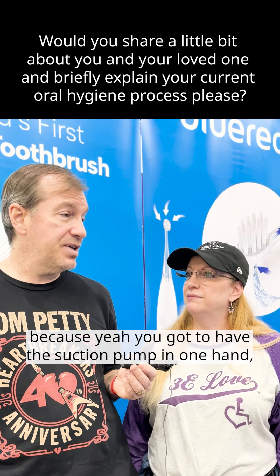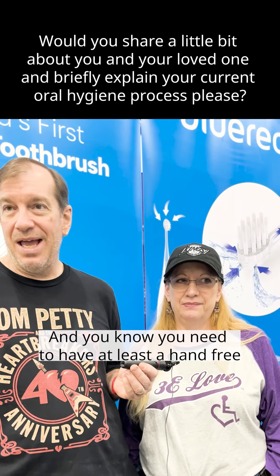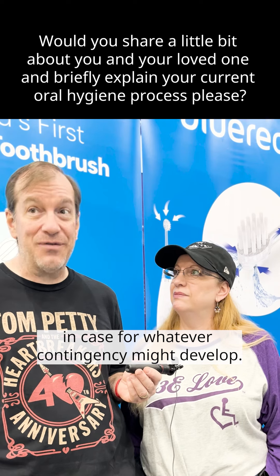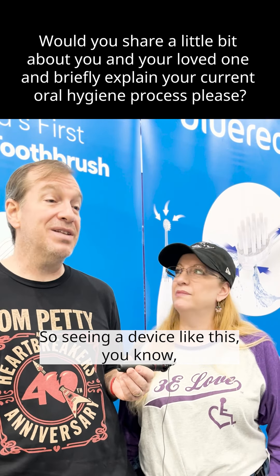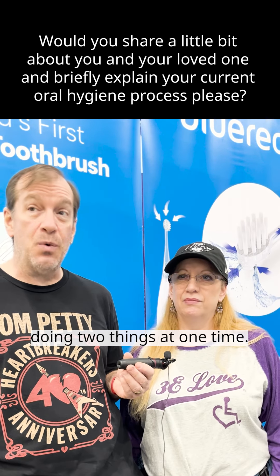Yeah, it's very tough to brush her teeth because you've got to have a suction pump in one hand, a toothbrush in the other, and you need to have at least one hand free in case, you know, for whatever contingency might develop. So seeing a device like this just all of a sudden doing two things at one time.